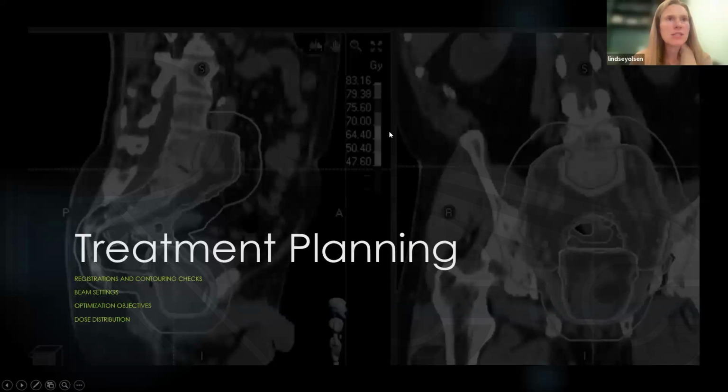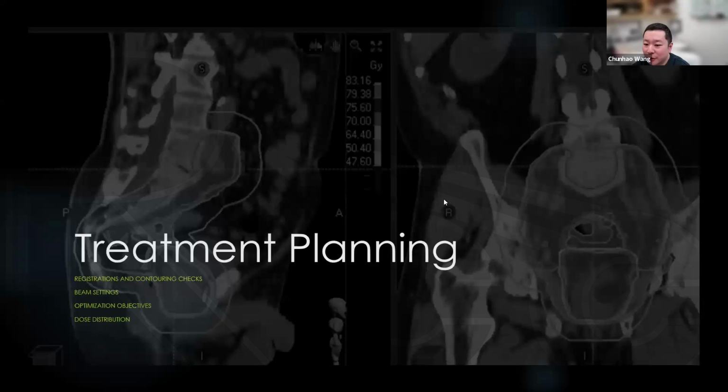I'm going to pause just here. We have one question in the chat right now that maybe we can answer. The question is, what if part of the PTV had air, making it difficult for coverage? Should I override this? That's a great question. We were just talking about the simulation part, and we'll see something in the treatment planning section, so this question is a bit early considering the progress of our presentation. But in general, a short answer is it is what it is. If the PTV goes into air, this is because you're considering the possible motion. The target will be there.